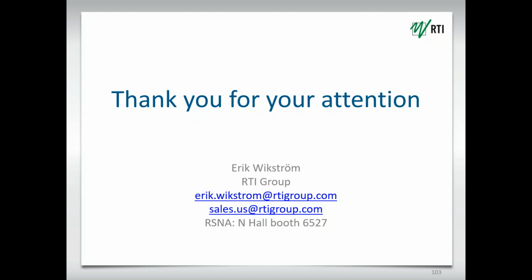For the license fee, you need to contact the sales guys in this regard, but the license is associated with the instrument as such. So if you're 5 people, you can share one license for the Ocean software.